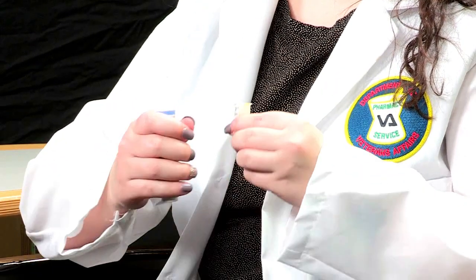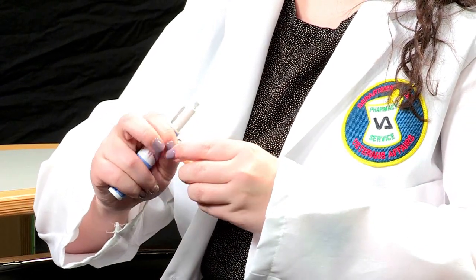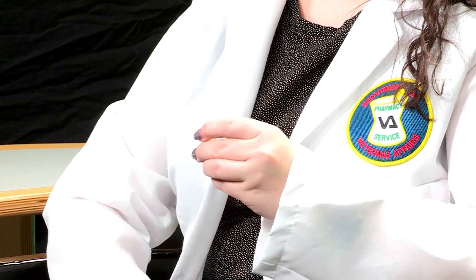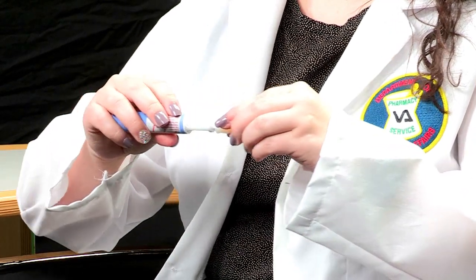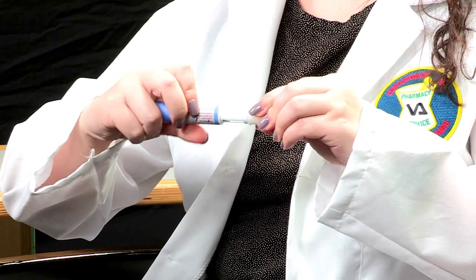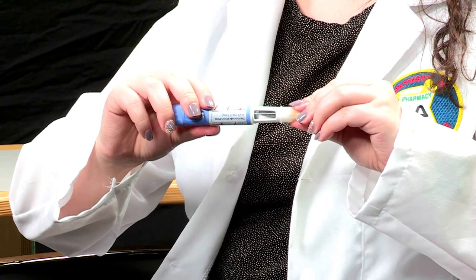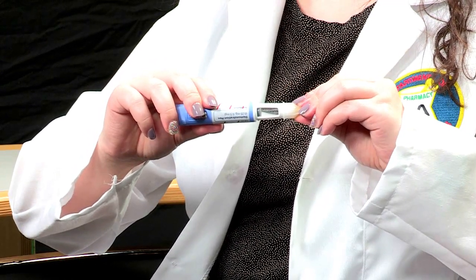The next step will be to pick up one pen needle. You will need to pull away the paper tab, push the needle straight onto the end of the pen, and twist until it is hand-tightened and secure. Make sure you do not over-tighten, as the plastic may crack or break, nor push the pen needle onto the pen at any angle.